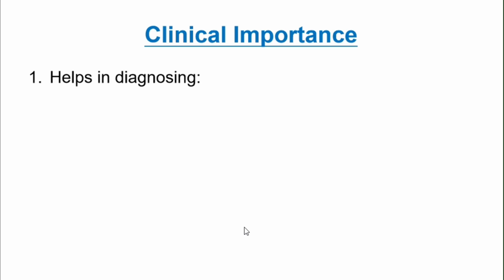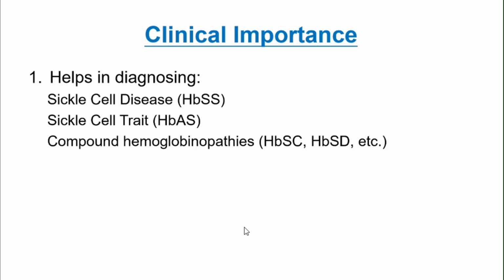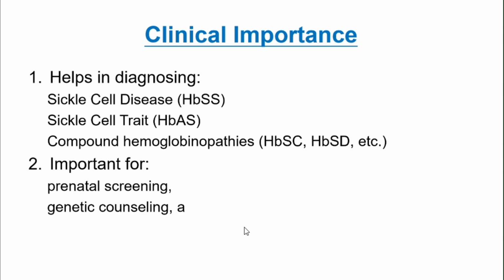Firstly, it helps in diagnosing sickle cell disease, HbSS, and secondly, it helps in diagnosis of sickle cell trait, HbAS, and compound hemoglobinopathies such as HbSC and HbSD can also be diagnosed, and it is important for prenatal screening, genetic counseling, and blood transfusion safety.